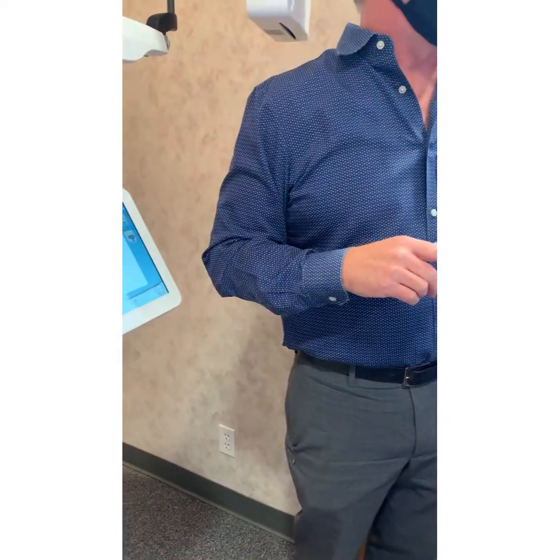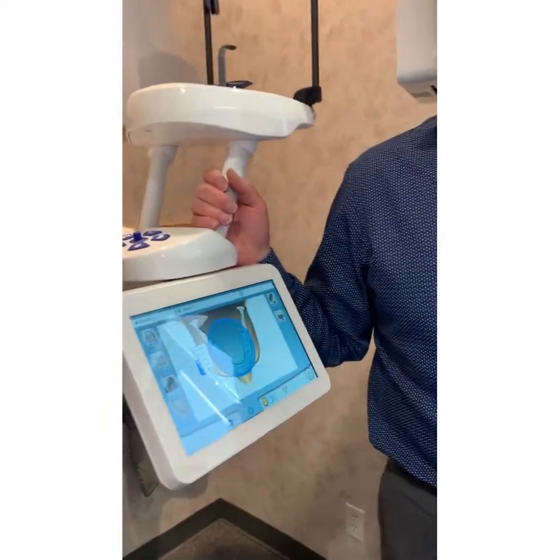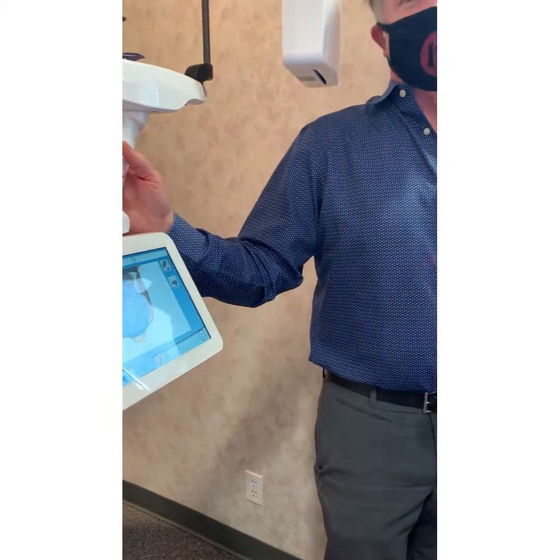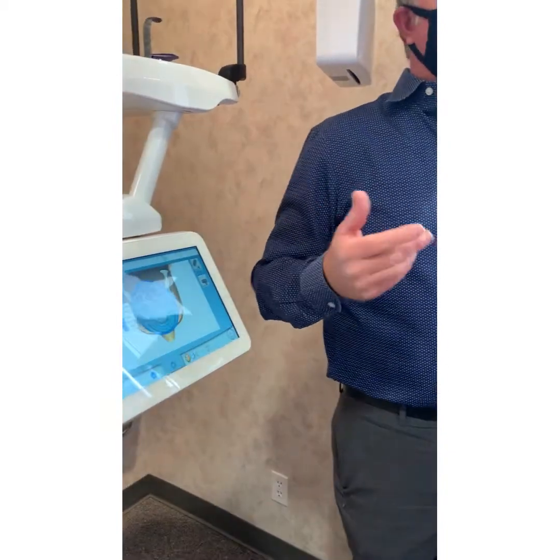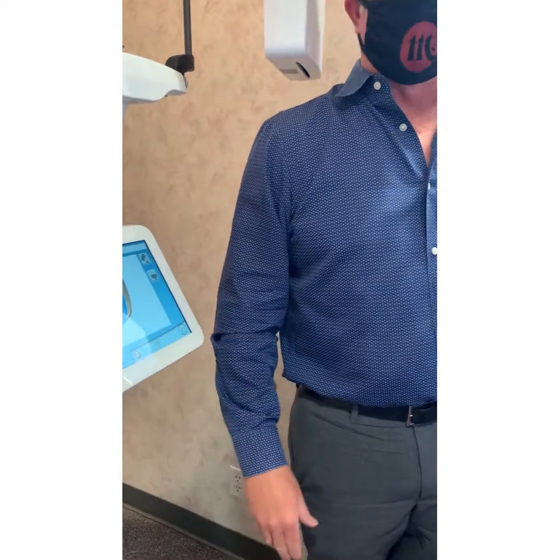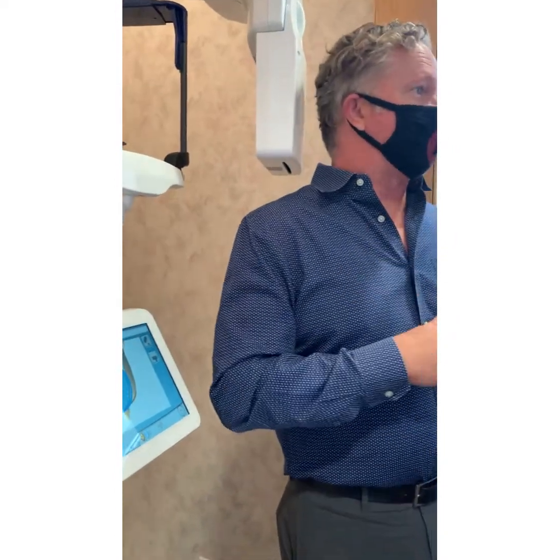Have you ever heard of beam readers? My spouse sends all of her scans to beam readers. Oh, really? David Hatcher and Frank Arasso are the guys that actually read her scans. The benefit is that it takes you out of the onus loop, but they're also going to find 6 other things. During your review of findings, you sit with the patient and say, we took it because we're going to place an implant here, but there are these lesions here, and I've got something going on over here. So it has that benefit as well.